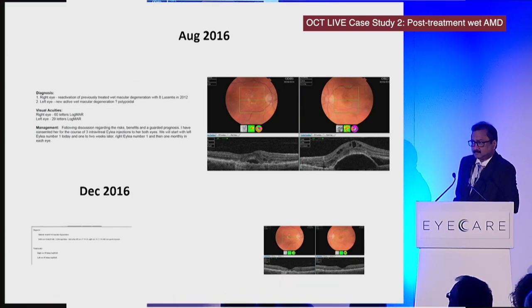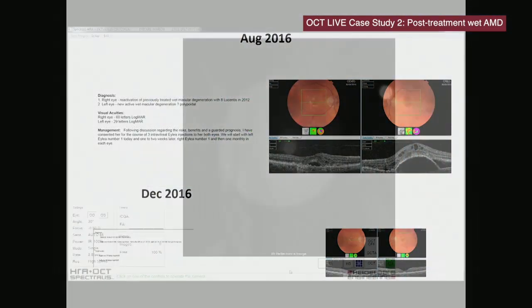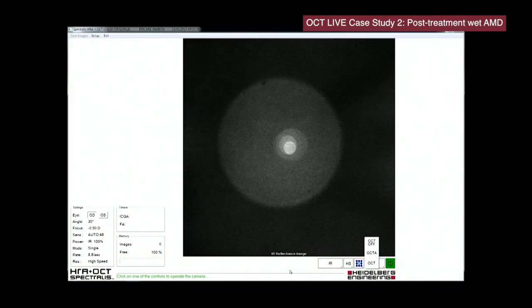Right, well now we're over to the live scan. So if we could go onto the instrument feed, please. And we'll start with Marion's examination.